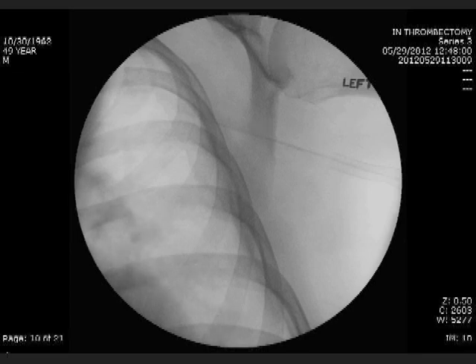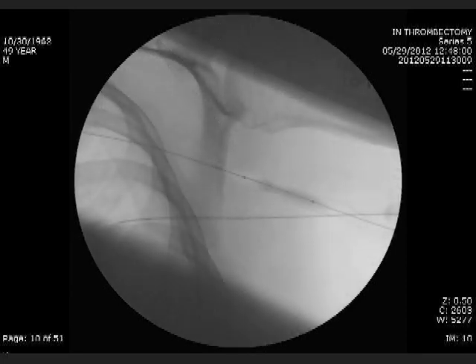This third case is also a patient of mine who presented to the Access Center with a clotted axillary artery to axillary vein loop graft. This is the initial angiogram of the pullback demonstrating the significant stenosis at the venous anastomosis at the proximal end of his existing stent. I first performed a percutaneous thrombectomy and then an angioplasty of the end stent stenosis with an 8 mm by 4 cm Conquest angioplasty balloon.